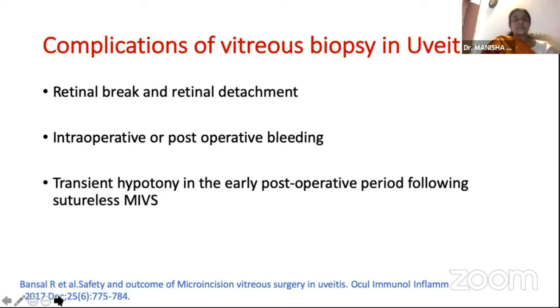Well, vitreous biopsy also doesn't go without complication. There's always a risk of retinal break and retinal detachment. You can also have intraoperative or postoperative bleeding. There can also be a transient hypotony, especially if you are doing a sutureless MIVS technique for collection of the vitreous samples.